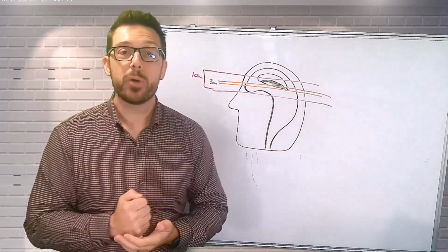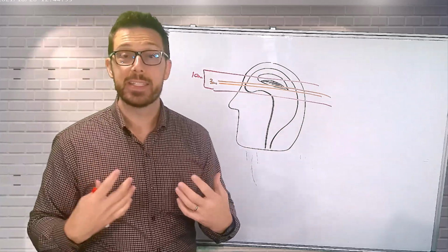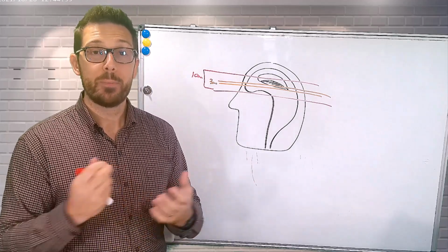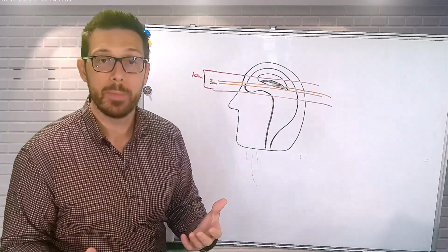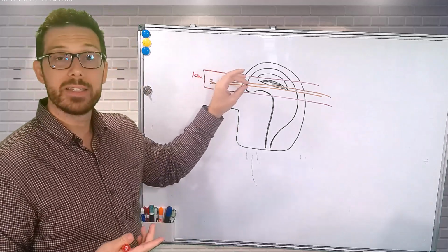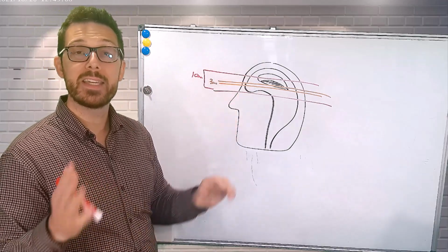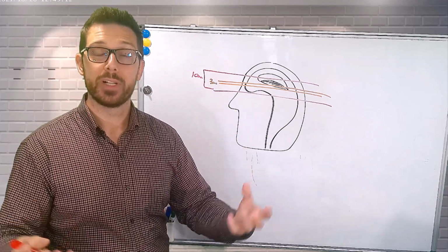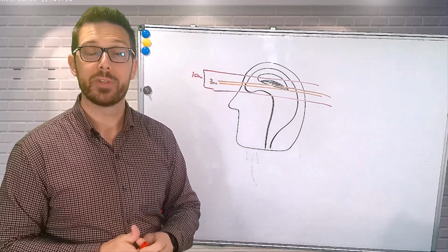Now, you might have noticed that there are some benefits. I like making these slices thick because I get more SNR, signal to noise ratio. But the problem is I'm starting to blur my image. So the remedy for this artifact is to use thinner slices. Yes, it robs us of some signal, but overall, our image is going to look sharper, clearer, and better, as long as we compensate for the SNR decrease.